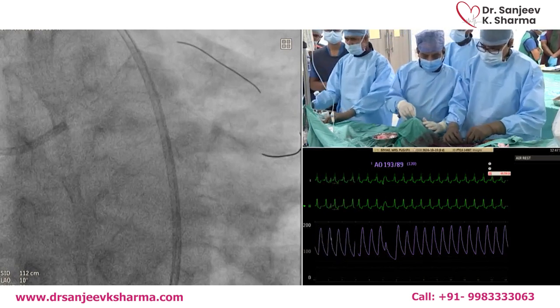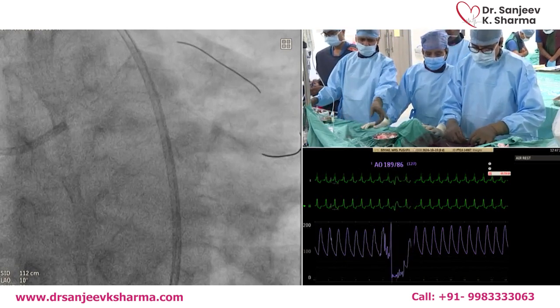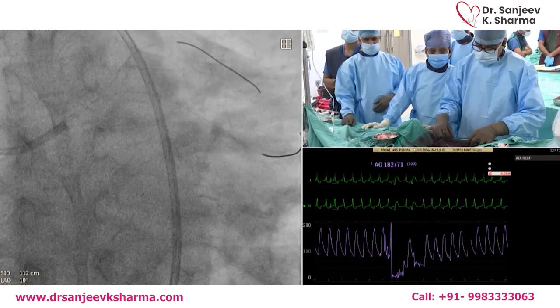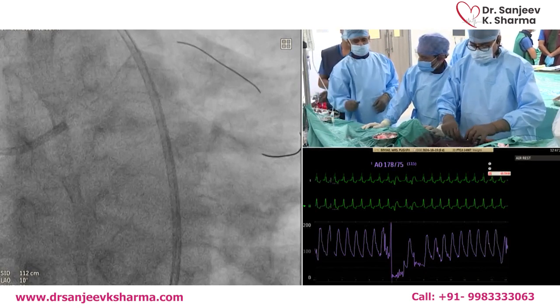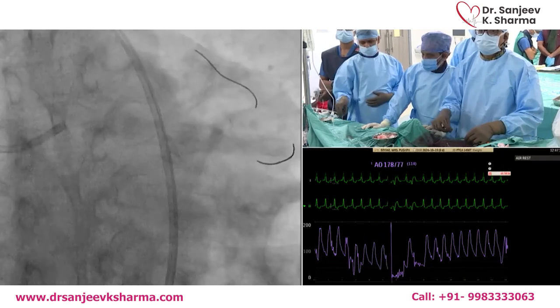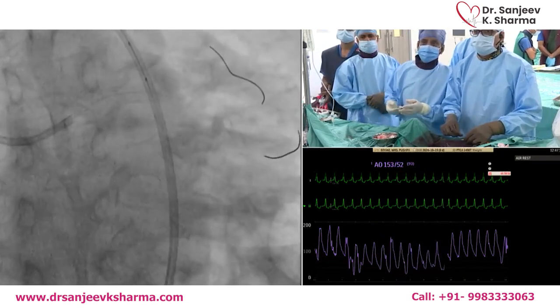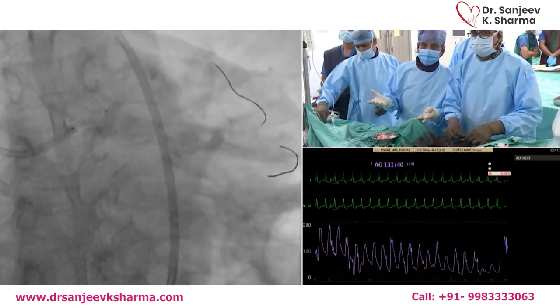Trial name is actually Fracture, and will probably start in January of next year. It uses both ultrasonic and the laser energy device. So the two other devices are starting the trials, and by year end, my prediction is that by the end of 2025 we'll have at least these, because these are all single arm studies, no randomization needed.